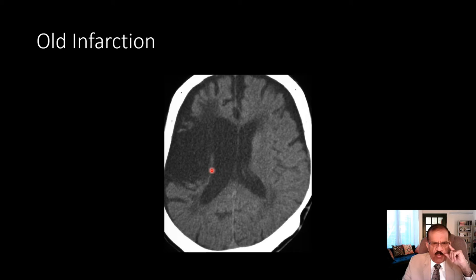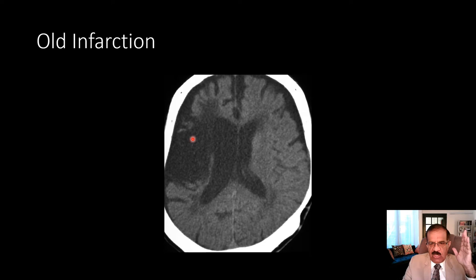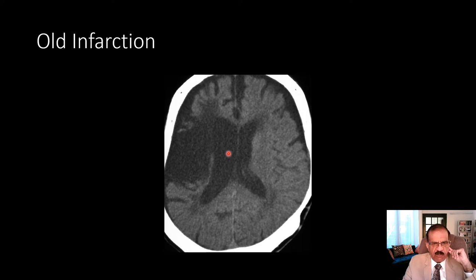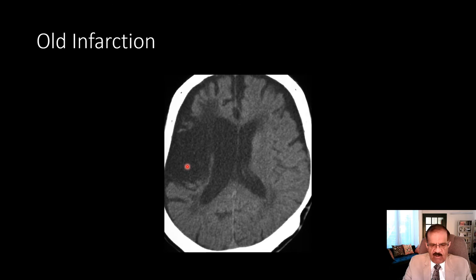This is an old infarction. What happens in old infarction is that brain tissue becomes liquefied — the intensity is equivalent to that of CSF. Initially there is no change in volume, then gain of volume, and eventually loss of volume, meaning it provides more space for the ventricles to expand. The right-sided ventricle is bigger than the left, expanded because it is pulled to that side. The brain is shrunken — this patient may also have background cerebral atrophy. This is an old large infarction in the vicinity of the right middle cerebral artery.